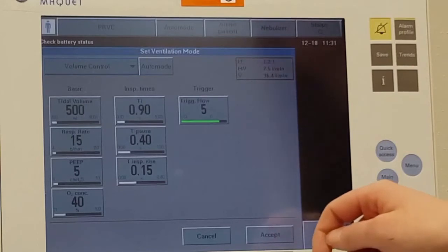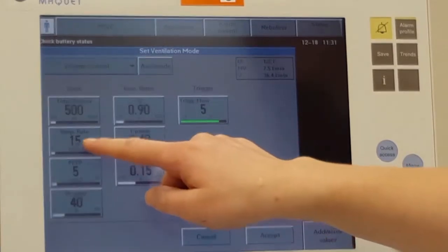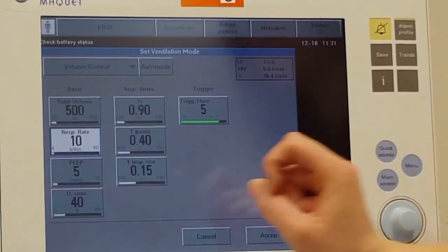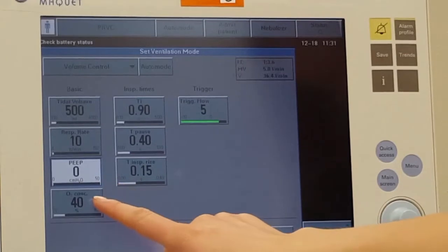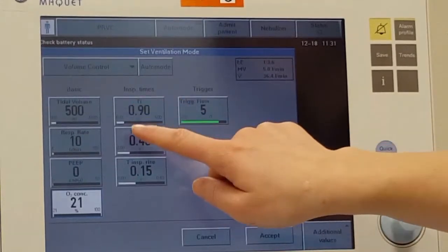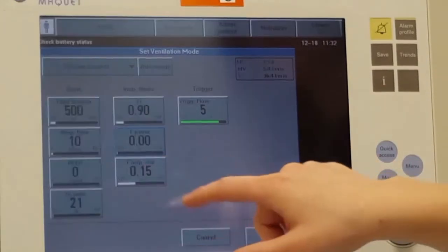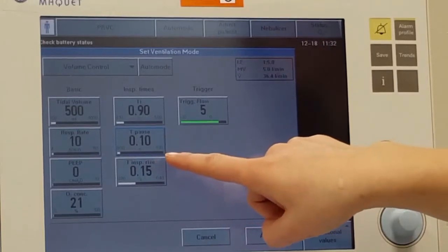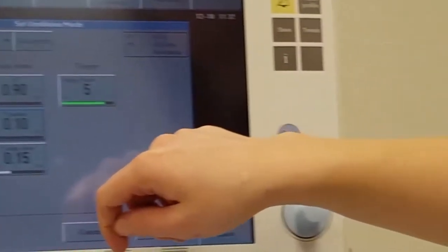So our initial order is to place them on 500 tidal volume. We're already there. A respiratory rate of 10, a PEEP of 0, an FiO2 of 21, an inspiratory hold of 0.1 of a second, and an inspiratory time adequate to give us a flow of about 50 liters per minute.